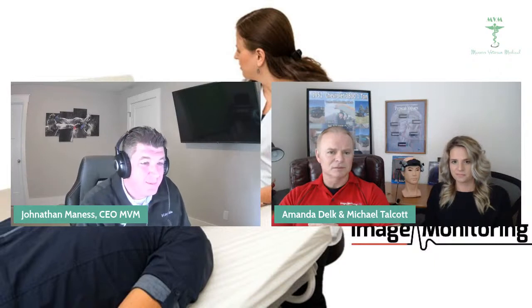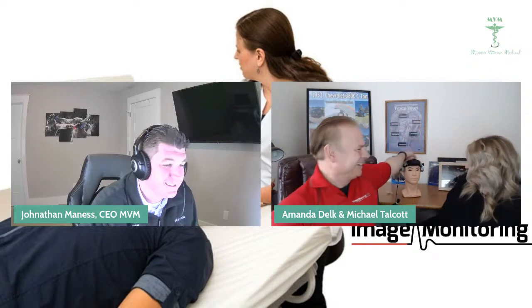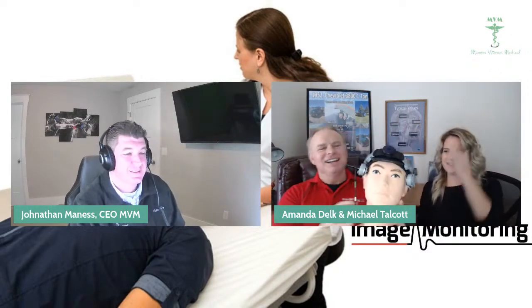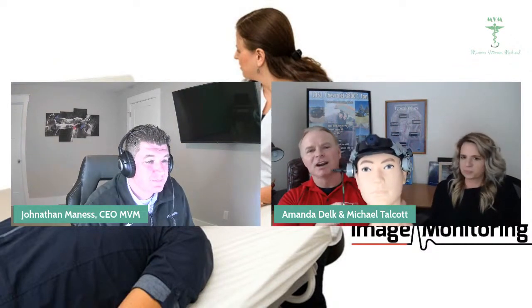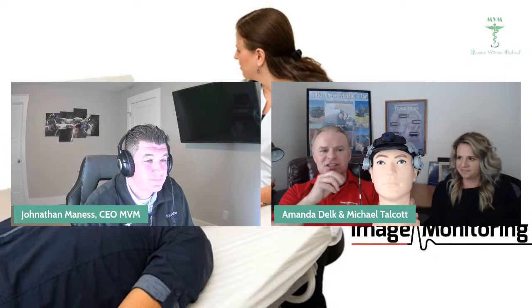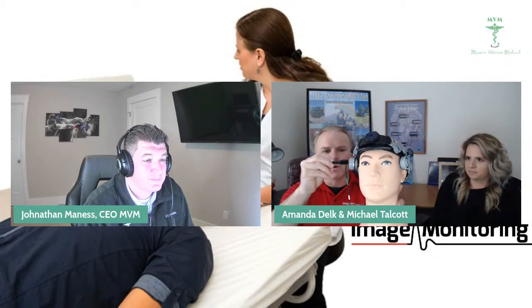Beautiful. So I got to know, what's the dummy there in the middle? What is that back there behind y'all? This guy right here. All right, this is our TCD headset, and this is something that you would wear if you were doing a PFO exam. What we would do is put this on you. These right here are Dopplers. This guy can come off. This is just for orientation.